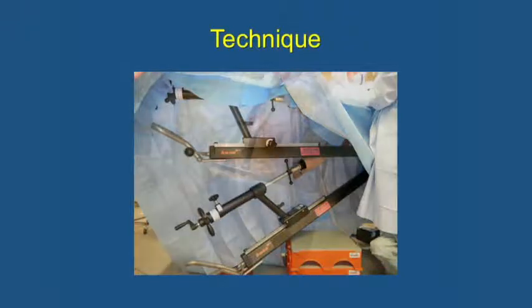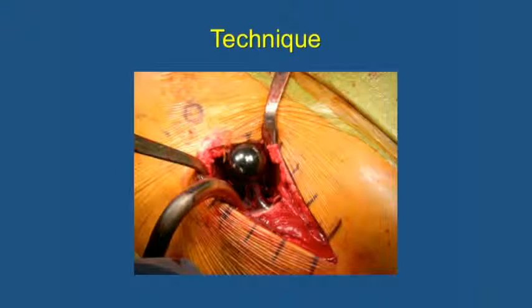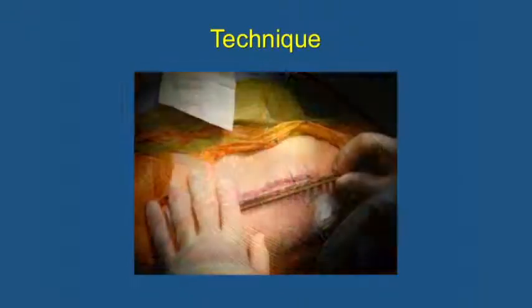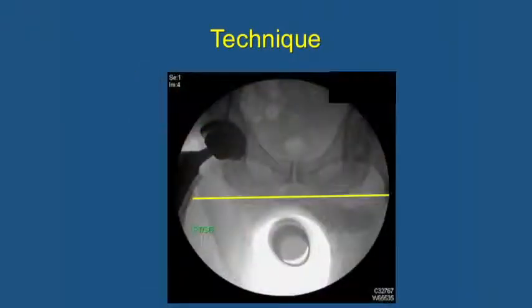This is how we use that table. We move the leg around, the operative leg, we bring it down and over, and we're trying to deliver your thigh bone up so that we can put the stem in. Trying not to gross you out, I try not to show too much blood or tissue. But that's that hook pulling the thigh bone up. There's the final implant. That's the metal ball. And the stem in there. There's the total incision right there, not too long. There's our leg length, showing that we have pretty equal leg lengths in the operating room. There's our final x-ray.